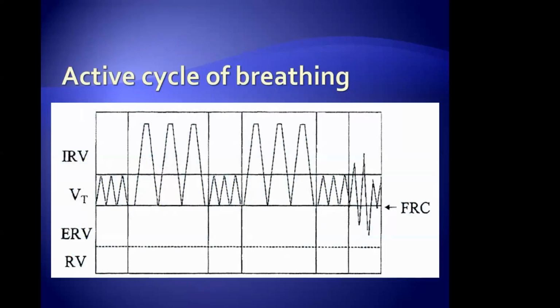Again, for the waveforms, here it is. So active cycle breathing is what's going on. We had to learn this in school. Those of you that do PFTs understand all this. We see these waveforms in mechanical ventilation. Well, here's what it looks like, just a normal active cycle breathing. And the thing that I like about this is, where does gas exchange take place? At the FRC. I'm wanting to increase FRC so I have better gas exchange. And that's exactly what we want.